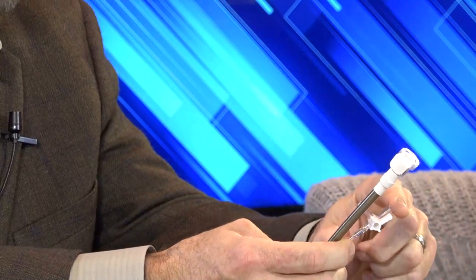The stopcock on the back end here is a flush port. That's a great question, by the way. Now that we have an oversheath as opposed to a balloon, I'll go ahead and separate the whole thing out. You wouldn't normally do this, but I'll separate them so that you can see that you have two completely separate tubes here. Ah, now I see.